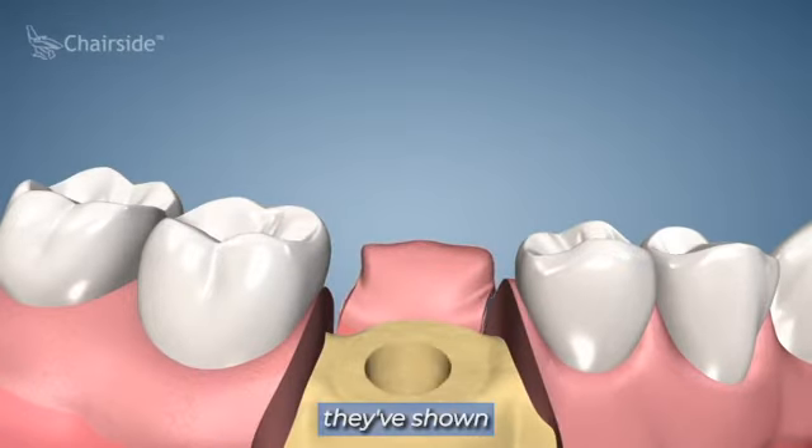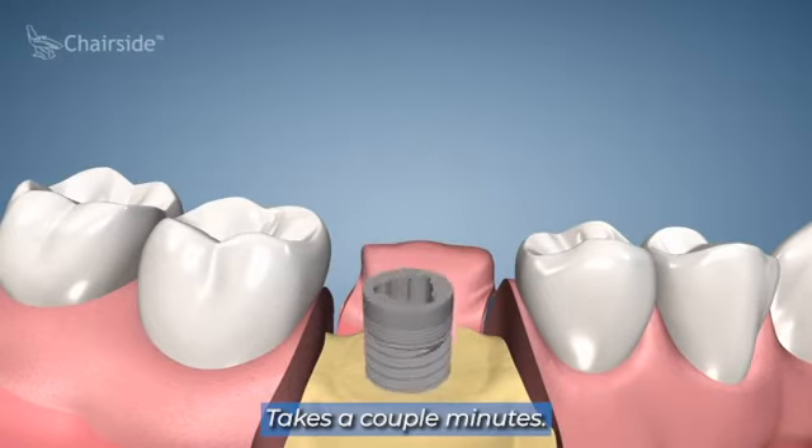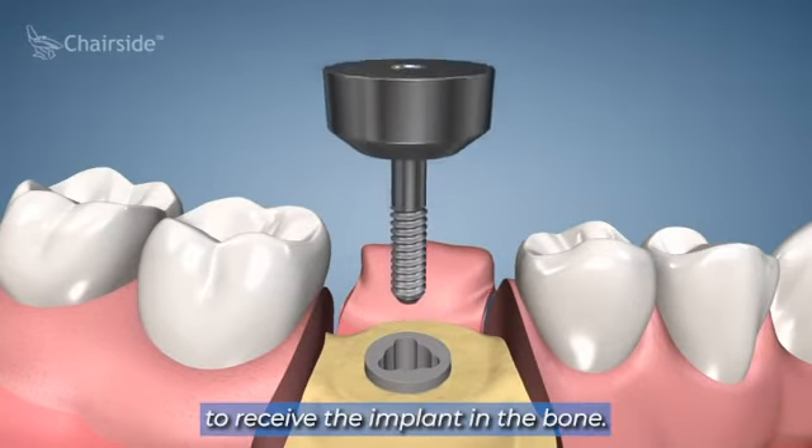At this point they've shown the osteotomy in the bone — the hole placed in the bone for the implant. This is done pretty quickly, takes a couple minutes. There's no nerve fibers running through the bone, so you can't feel this part at all. Just pre-drilling a hole to receive the implant.